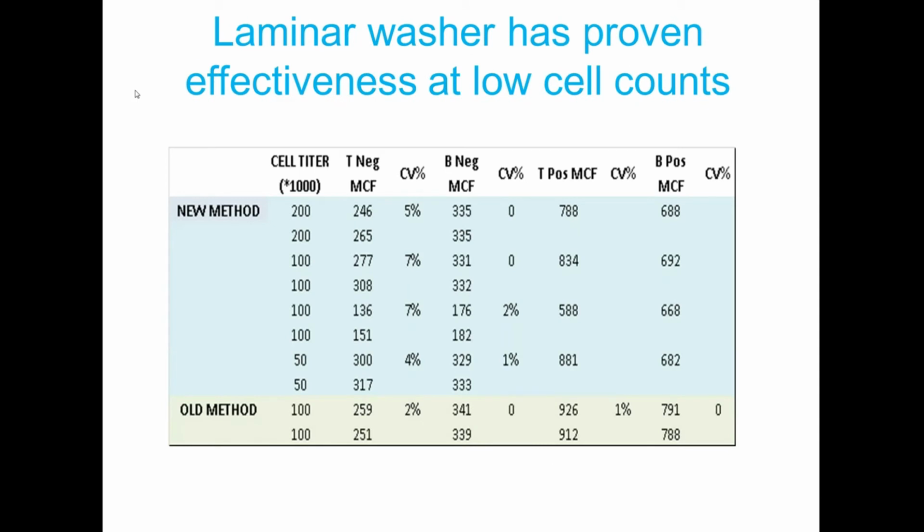So many of you know how it feels when you're working on a crossmatch and you receive very little or very poor quality of donor samples to use. And the transplant surgeon is already calling you in your lab and asking for crossmatch results because he's waiting in the OR and ready to transplant the patient. Don't you just love how they forget that our lab tests take up to 6 hours to complete? We are not a clinical chemistry lab that can obtain instant results from an automated instrument.